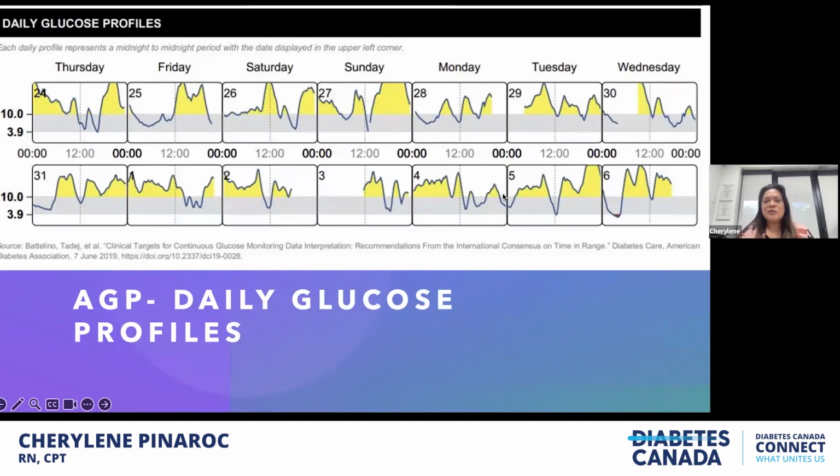This could be a discussion with the patients of when they're injecting their insulin, what they are eating for their meals, and whether they're injecting at the moment they're eating, or when. And then looking at the sites to make sure we're not injecting in the wrong place, or in fatty deposits. So there's a lot of room.